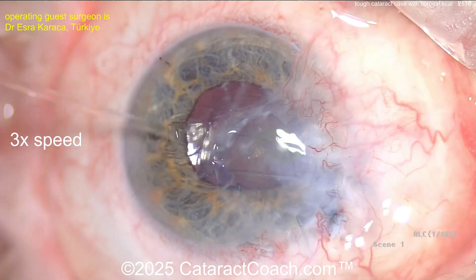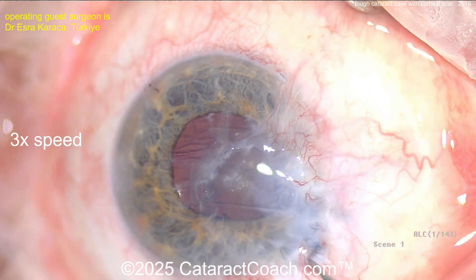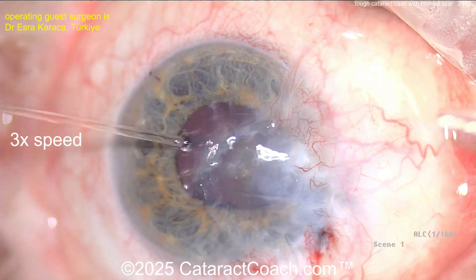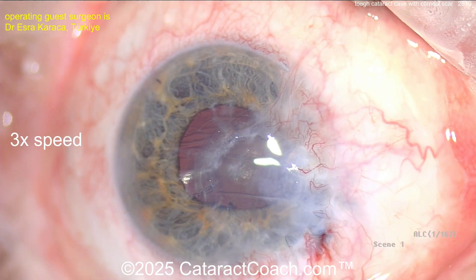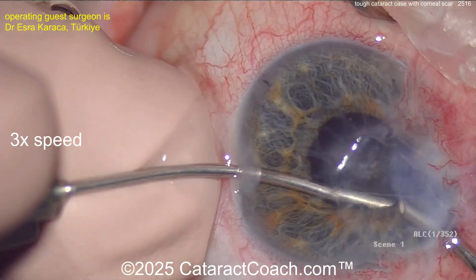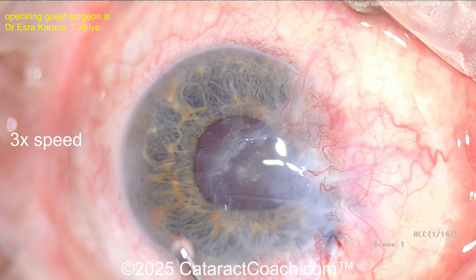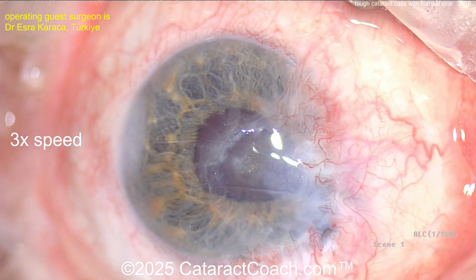Seal up the incisions and call it a day — no more manipulation. If I was doing this case, I'd make my phaco incision temporally and avoid making any incisions in the area with this conjunctival overgrowth or where the perforation was. Leave that alone. You can come back another day if you get tissue for a corneal transplant. Be very cautious — just clean it up, make sure it's absolutely watertight, and do a Seidel test with fluorescein dye. The patient will be pretty happy.